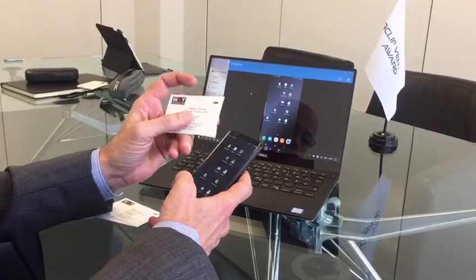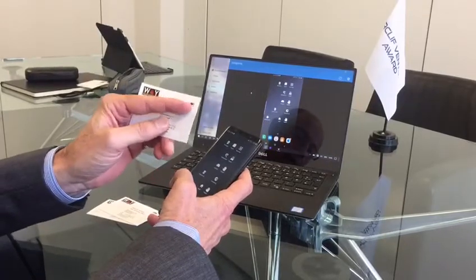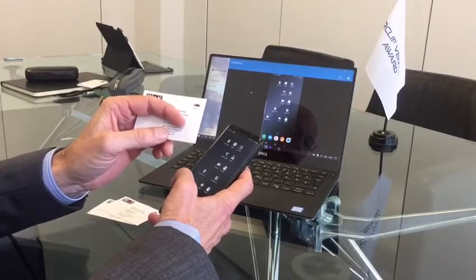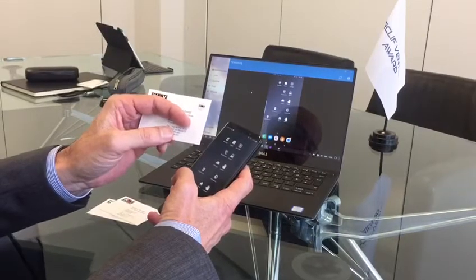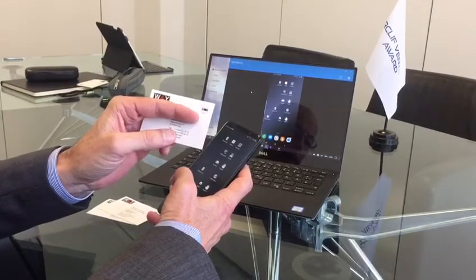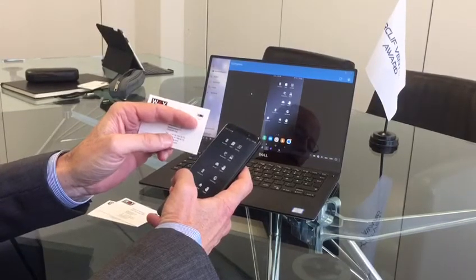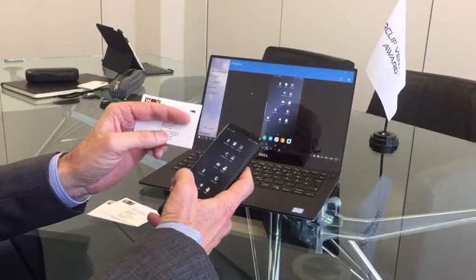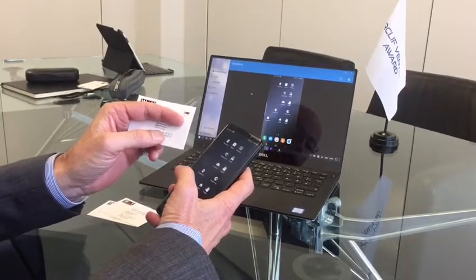First of all, let me just quickly show you what we are using. This little device, which you can see here, is what we are using for the identification purpose. In the later application, this part can be or will be used to apply to the fingernail, for example, of the user.